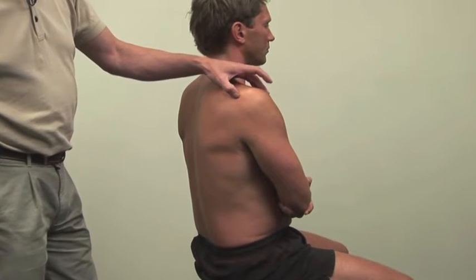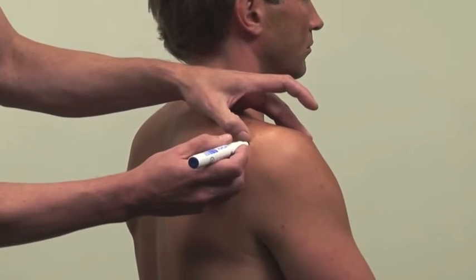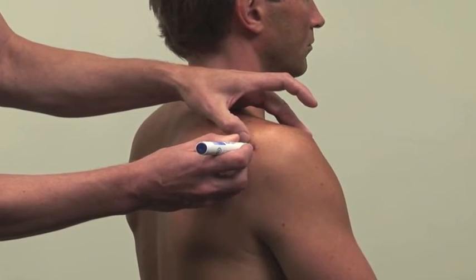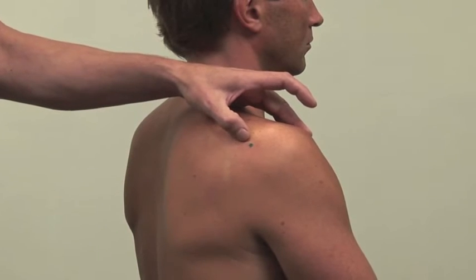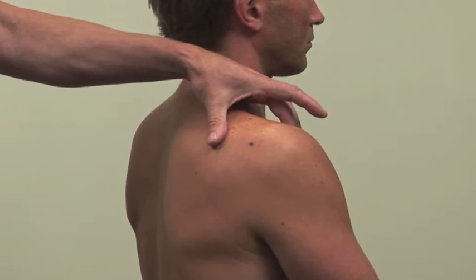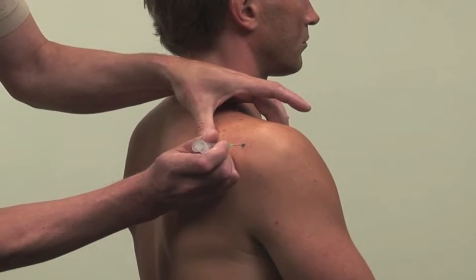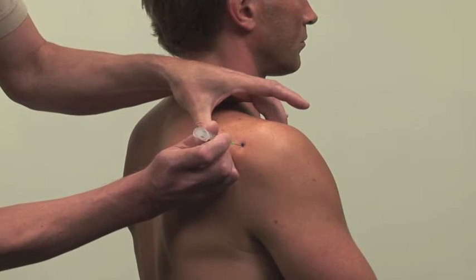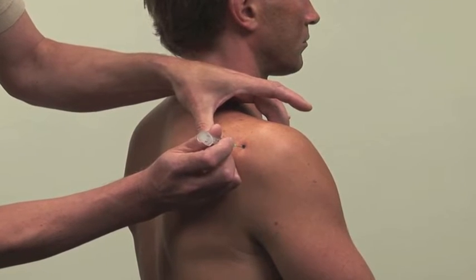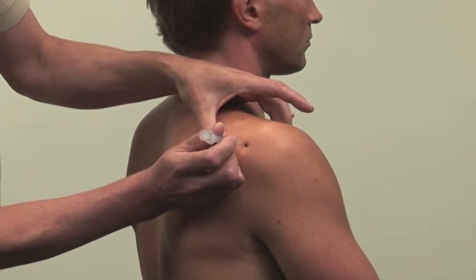Identify the posterior angle of the acromion with the thumb and coracoid process with the index or middle finger. Insert the needle directly below the angle and pass anteriorly obliquely towards the coracoid process until the needle touches intraarticular cartilage.